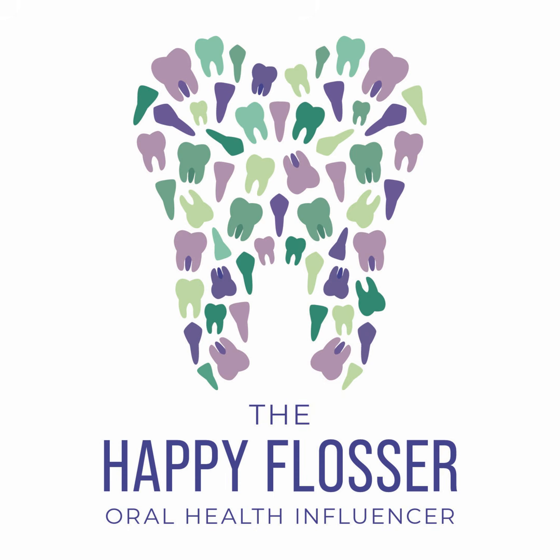So the key points I want you to remember is that the density shows up as the darkness or lightness of an image on your sensor. It's influenced by the kV, the mA, and the source distance. It's also influenced by what you're taking an image of. The most radiolucent item would be air, and the most radio-opaque item would be a metal. This is density in a nutshell. This is radiology density so that you can understand adjustments that might need to be made in order for you to achieve the best image for your patient.